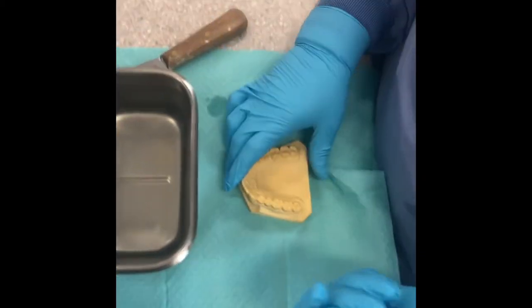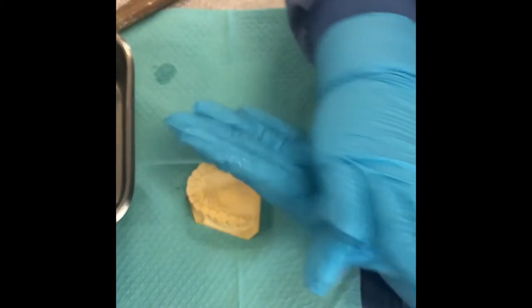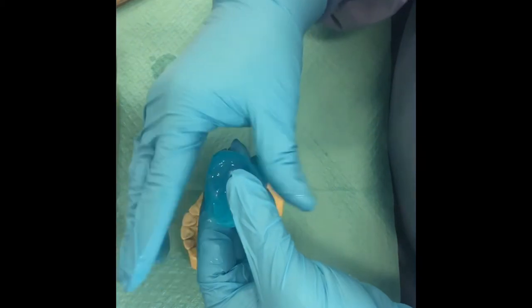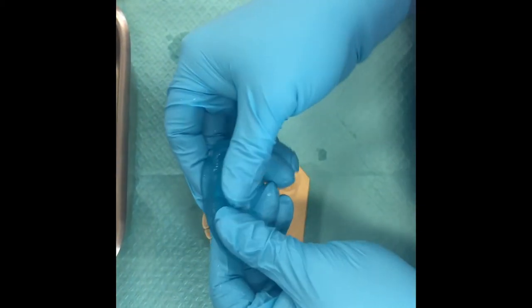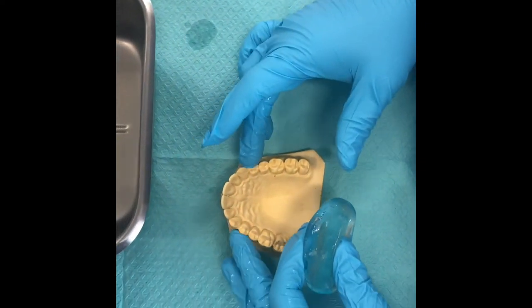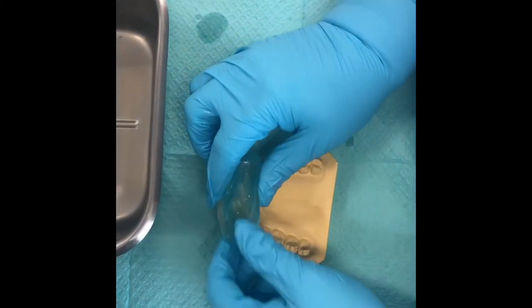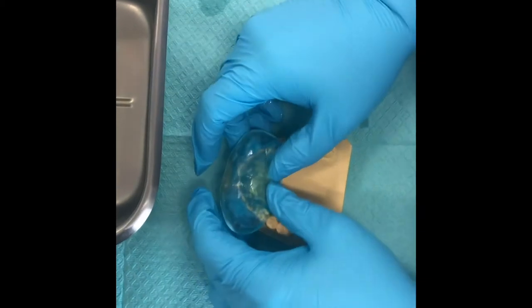You're going to use your maxillary model — the ideal set model from week one. Roll it into a ball, then shape it into what I call a little slug. We're doing a quadrant anterior tray, from about the first premolar over to the other first premolar, and lightly push it down.